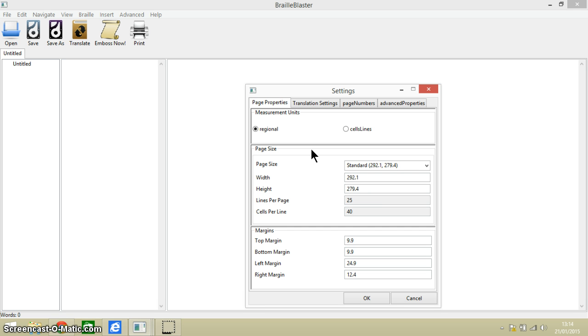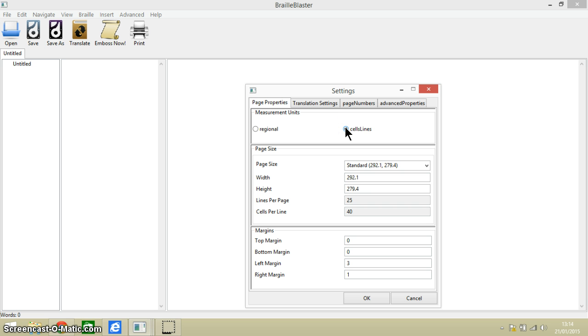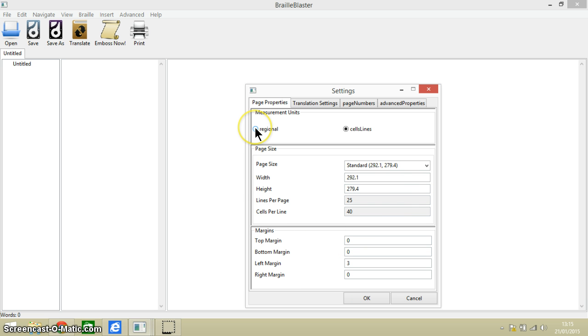Our first set of settings relate to the page properties. We can either choose regional or go to cells and lines here, and the cells and lines apply to these page margins at the bottom. So let's leave it on regional.